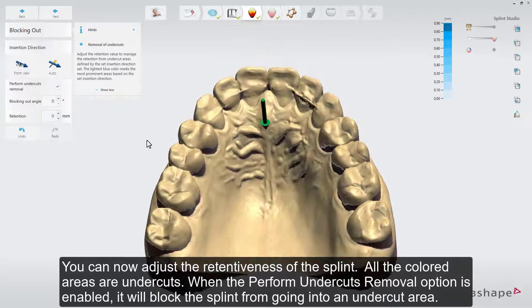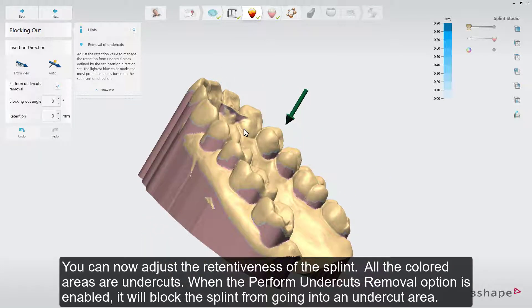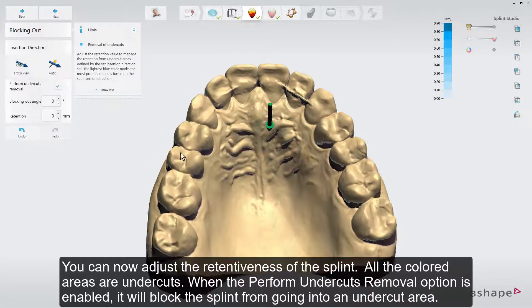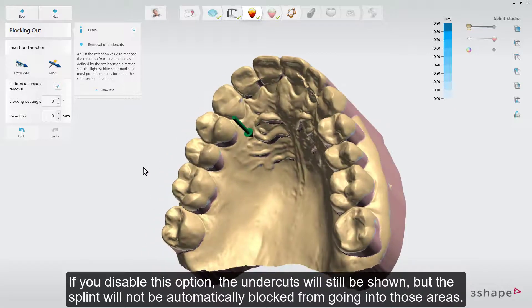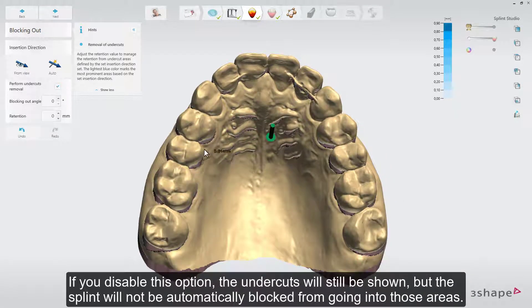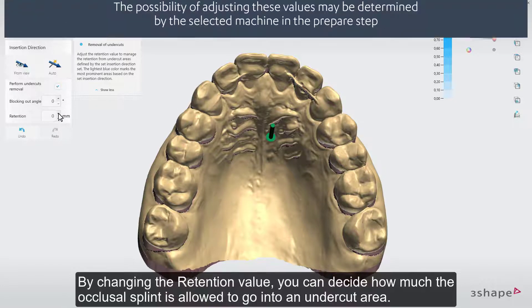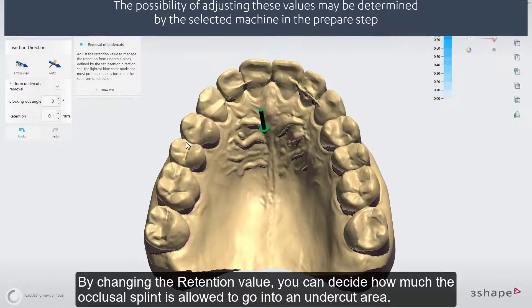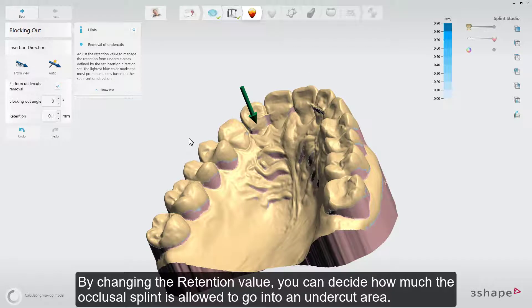You can now adjust the retentiveness of the splint. All the colored areas are undercuts. When the Perform Undercuts Removal option is enabled, it will block the splint from going into an undercut area. If you disable this option, the undercuts will still be shown, but the splint will not be automatically blocked from going into those areas. By changing the retention value, you can decide how much the occlusal splint is allowed to go into an undercut area.